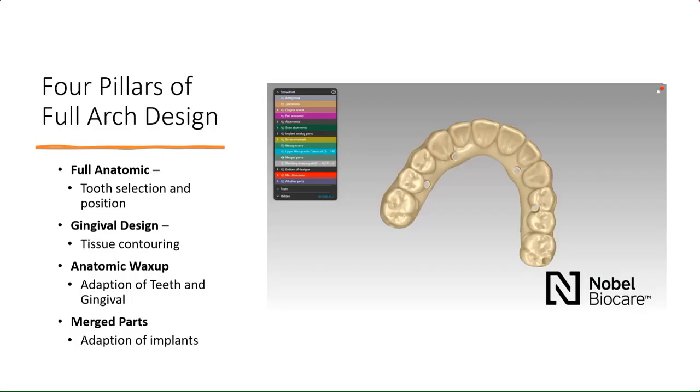My assumption is that you at least know how to do a single tooth implant, either abutment or implant crown, because when I start talking about matching and scan bodies and things like that, my assumption is that you're familiar with that terminology.